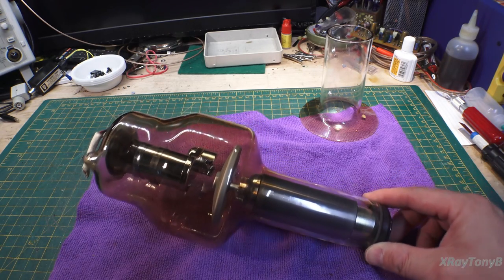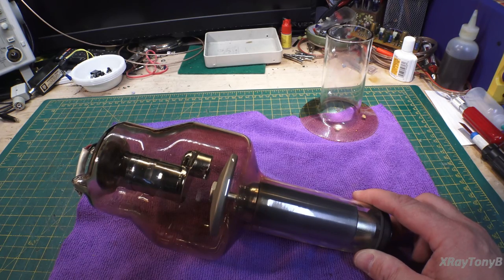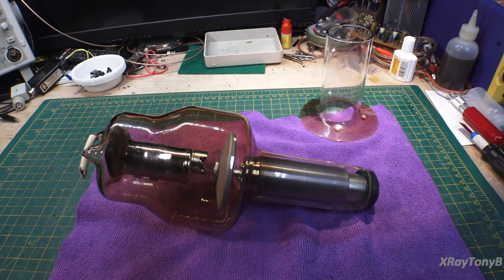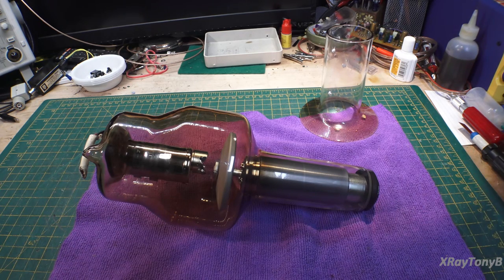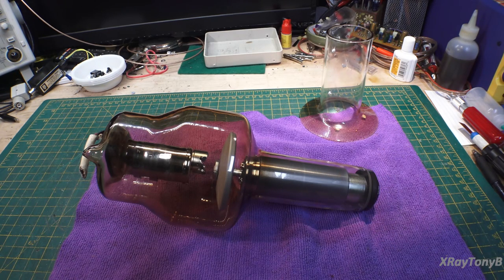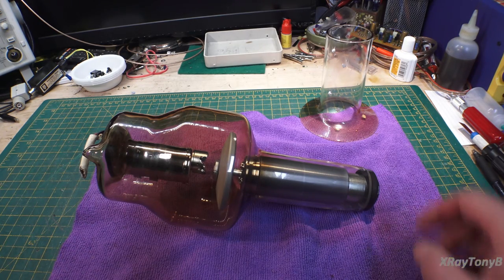Now, this is very similar in some ways to a regular vacuum tube that you're used to seeing. And we've seen lots of vacuum tubes on this channel and other channels. So there are similarities, and there are some pretty big differences as well. And I just wanted to give you an overview of this vacuum tube.